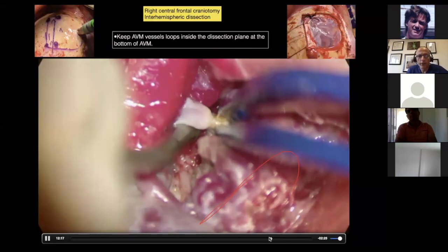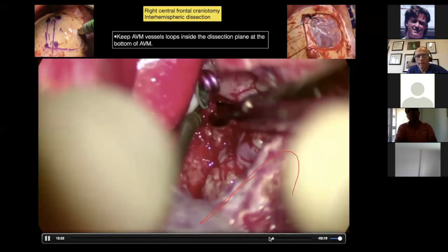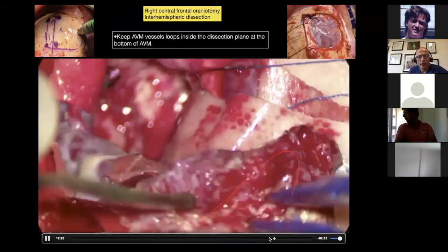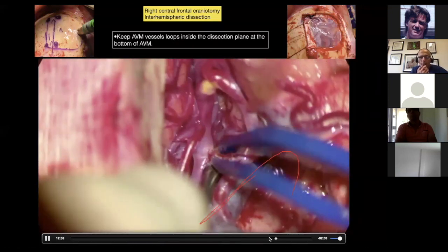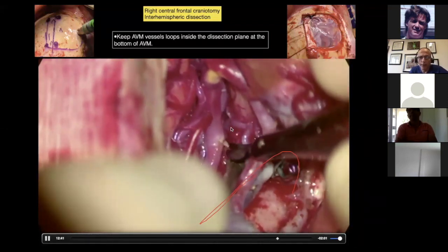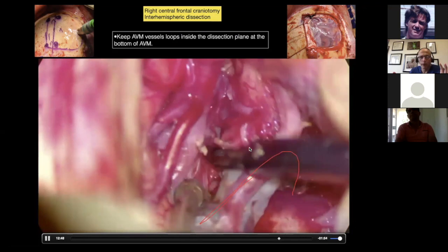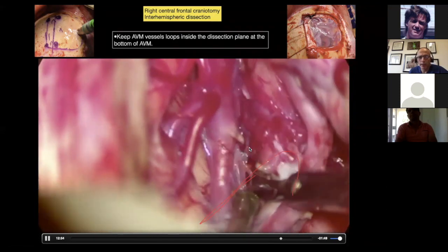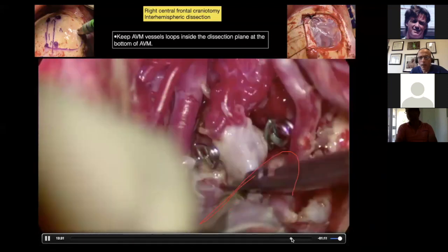Okay, lastly, we take the draining vein and put a permanent, strong clip. See, I took that, but there's an area I was suspicious of, see? And I wasn't happy with that area. So I went back to inspect, and I thought these are AVM vessels. Sometimes you can have dysplastic arteries surrounding the AVM nidus, but this wasn't one of them, and I decided to resect that small area. Okay, and then we did that.